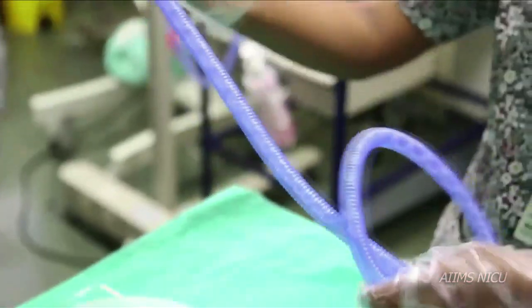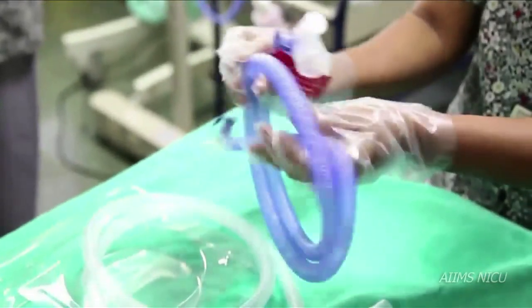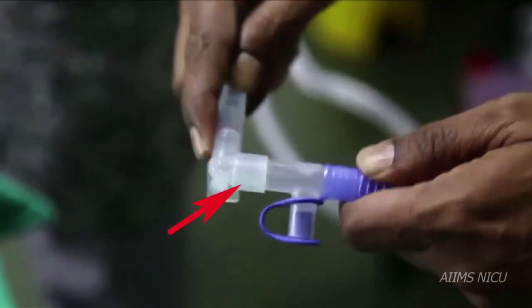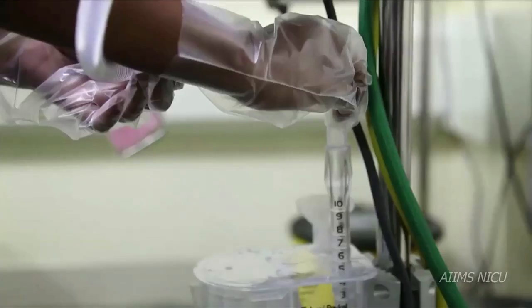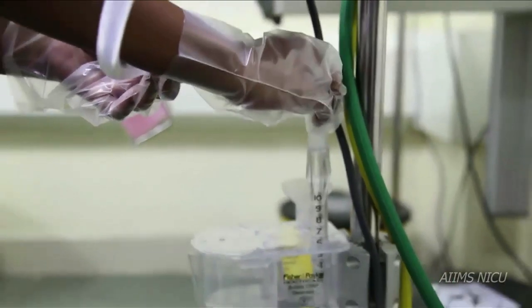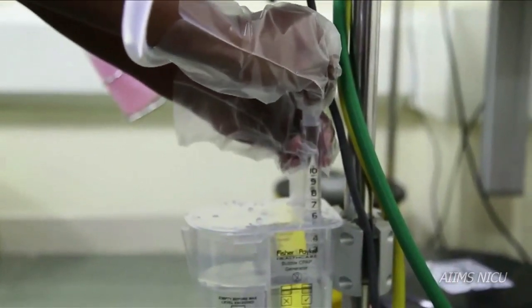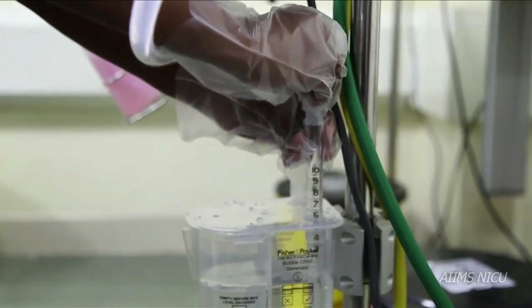Now connect the blue inspiratory limb to the other port of the water chamber. To the other end of the blue inspiratory limb, lock the white expiratory limb of the bubble CPAP circuit. The second end of the expiratory limb is connected to the bubble chamber.